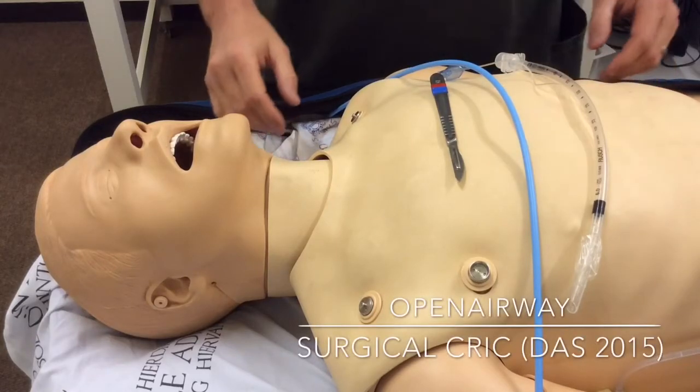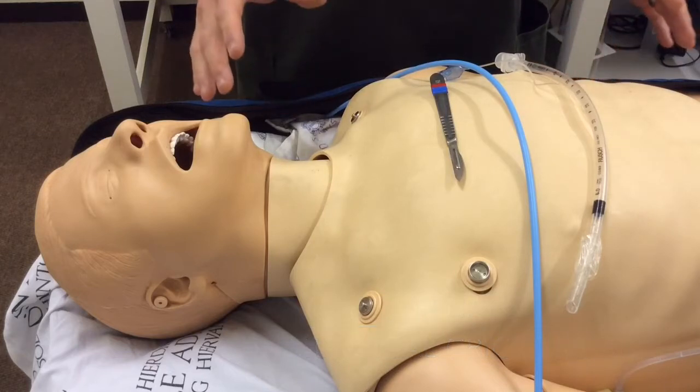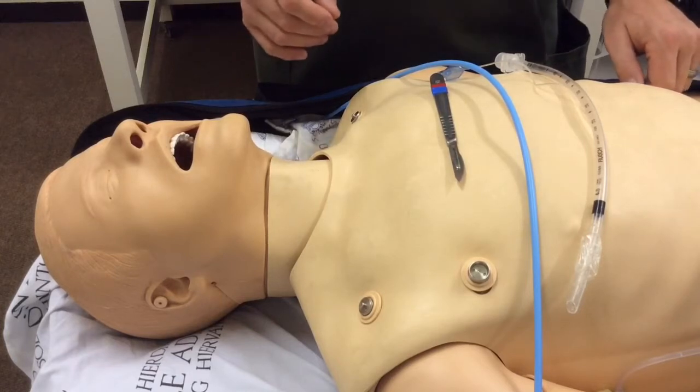Hi folks, Ross here from Open Airway. I'm in the ECT Anesthesia Airway Skills Lab and I want to go over in this short video the Difficult Airway Society's 2015 guidelines surgical airway technique.